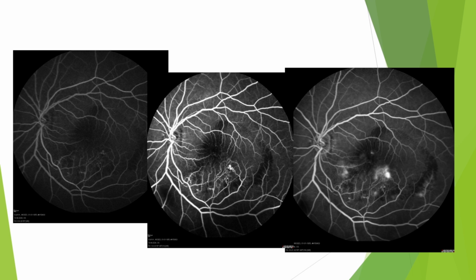This is the early arterial phase of the fundus fluorescein angiogram, showing some vascular hyperfluorescent areas. What phase? Early arterial phase.